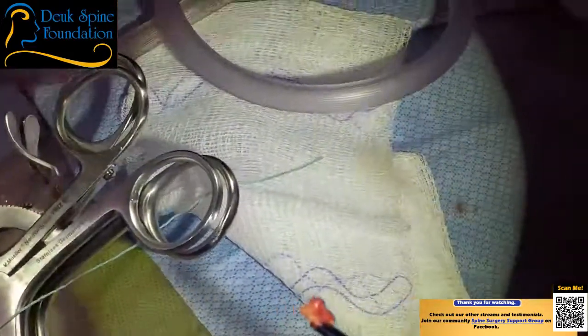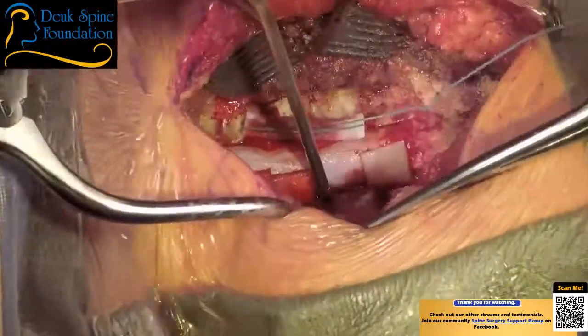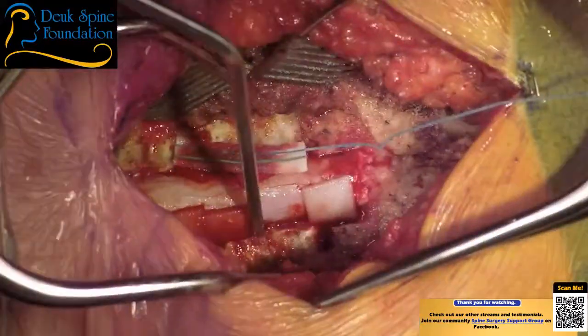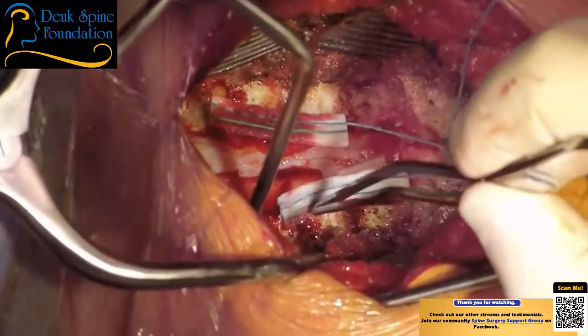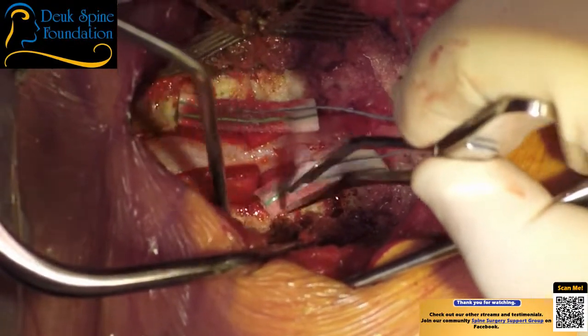Again, more thickened ligament. Ligamentum flavum. Gelfoam. We're going to be done in 30 minutes. Closed. I'm telling our anesthesiologist, Dr. Fu, suck here, please. Gentle, gentle, gentle. Good.